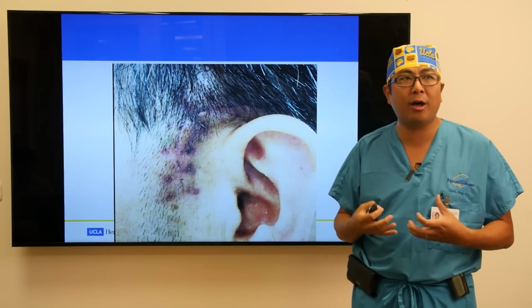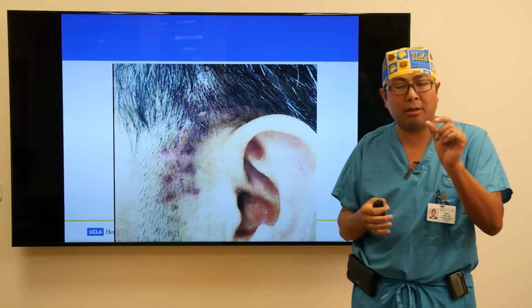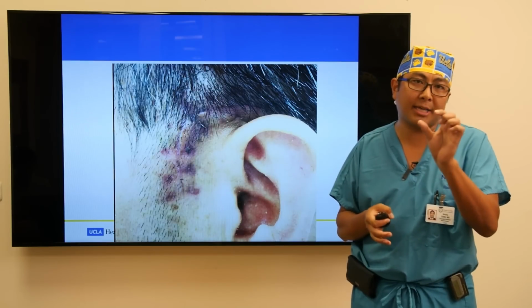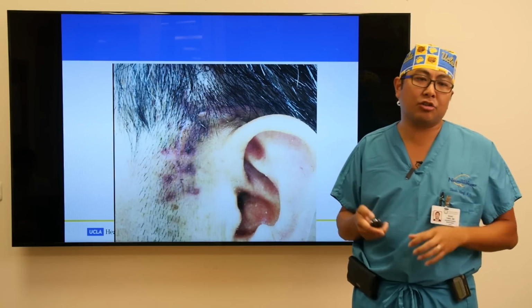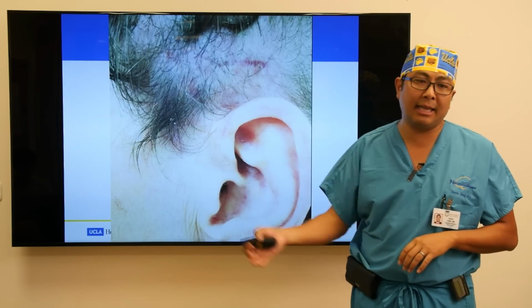It's hidden really well because our incision gets smaller because our opening is smaller. And so using a minimally invasive dime-sized hole, our incision is approximately 1 inch, and that makes our scar much smaller. And this is what it looks like significantly later after the incision.